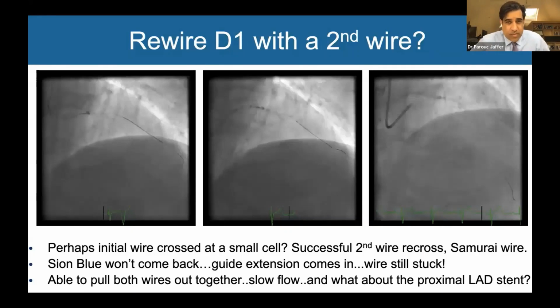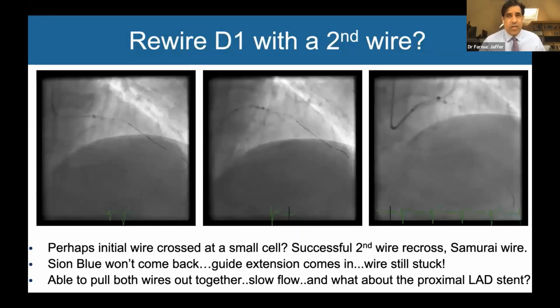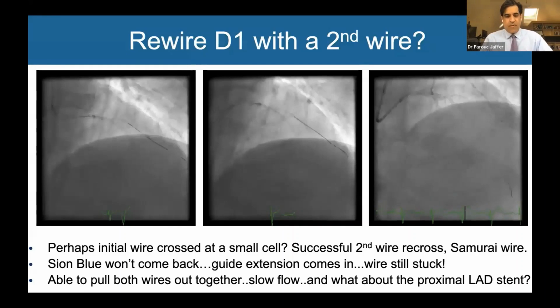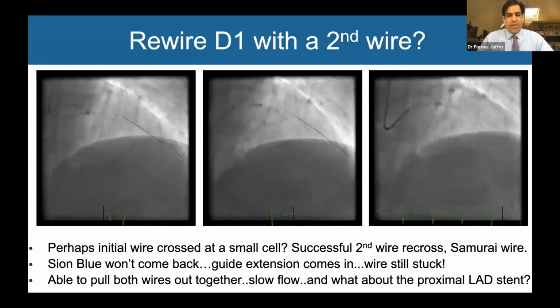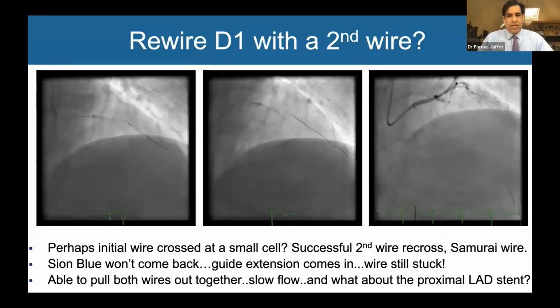reduced. And while this is a total occlusion and there's some collateralization because of his higher risk stress test, we certainly were aiming for complete revascularization and interested in trying to keep that diagonal open. So we thought, all right, well, let's go back and try to re-expand the stent and recross.